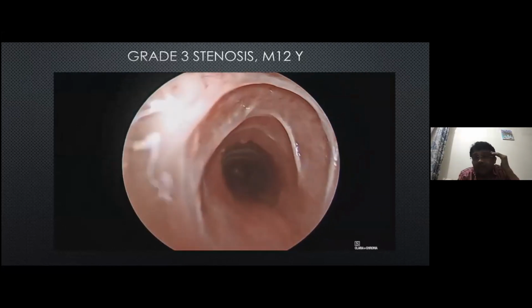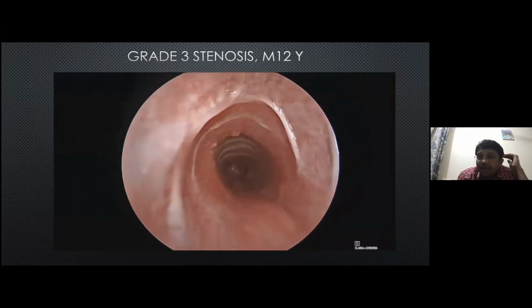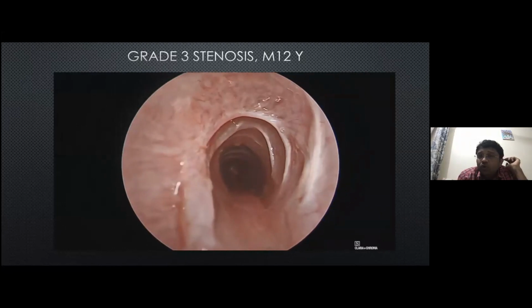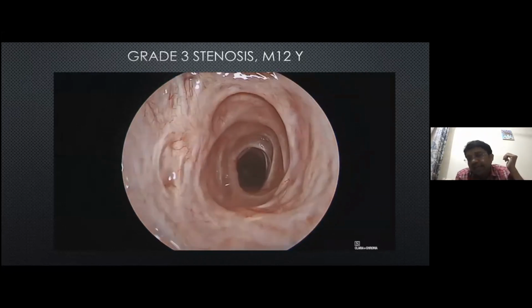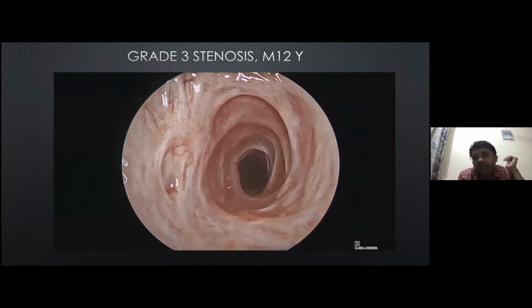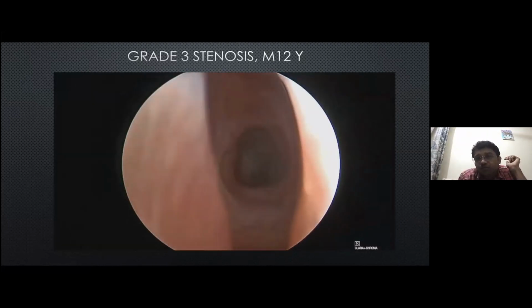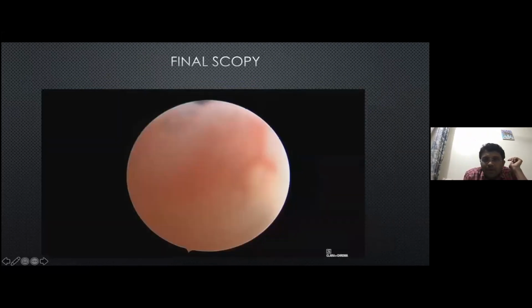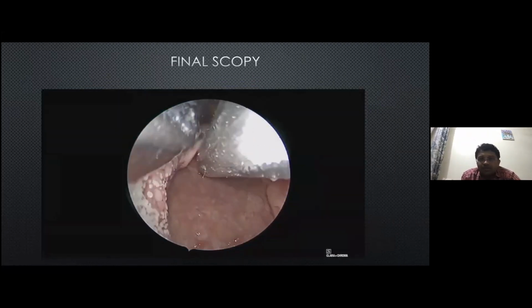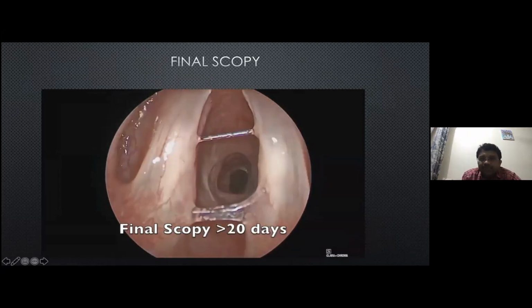Whenever we take the patient for a scopy, we ask them to climb a flight of stairs and we see if any kind of dyspnea is there while doing the flight of stairs. Here you can see it has mucosalized so well. Yes, sir. That's it, sir.